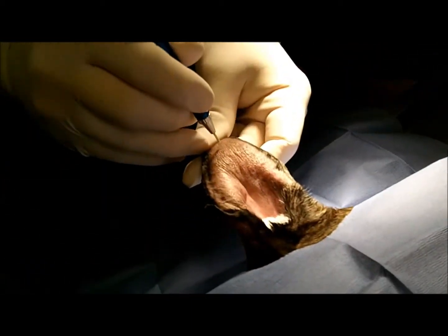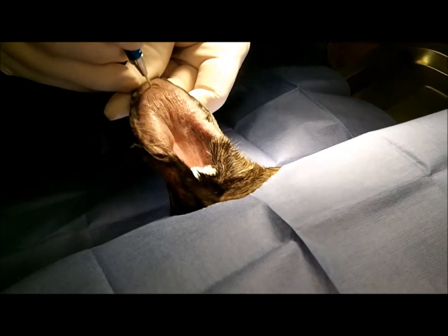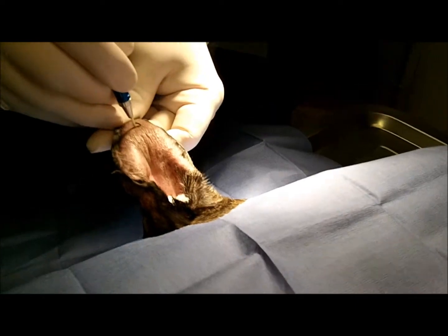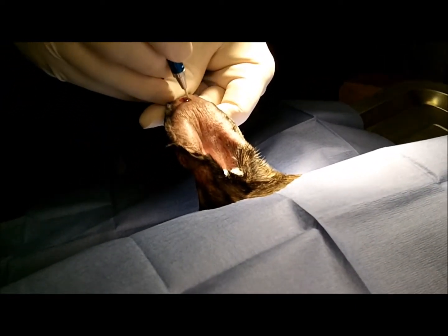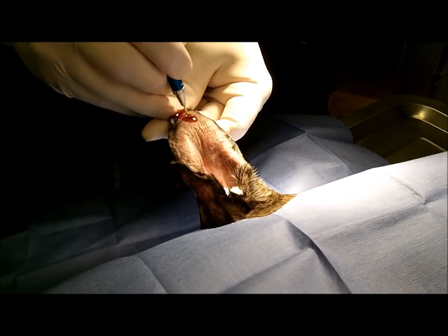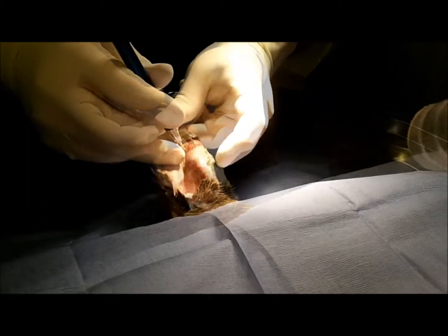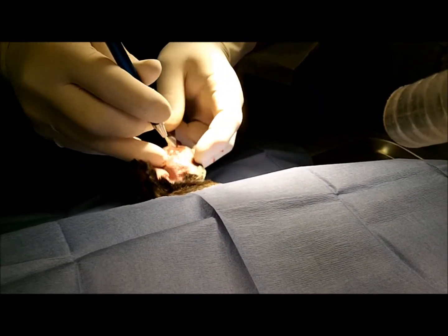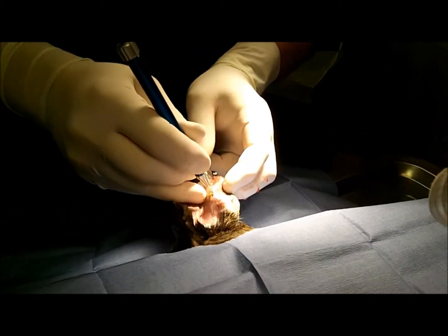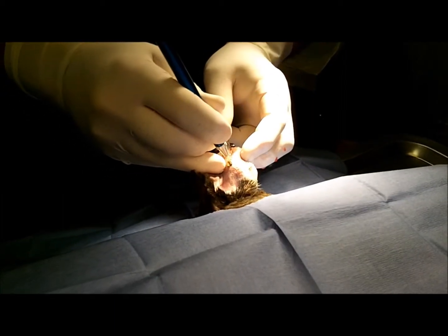Here we're showing the ear that is affected. I'm getting ready to make an incision with the laser on the tip of the ear. You can see we're making a little circular incision. I'm going to extract some fluid. A lot of times we have an accumulation of fibrin tags and things like that in there.